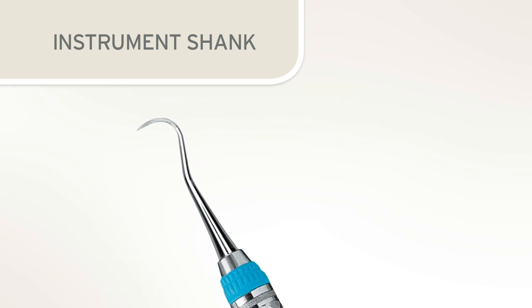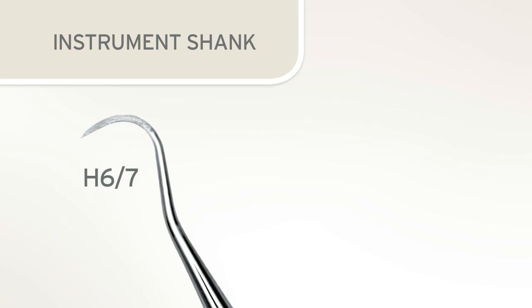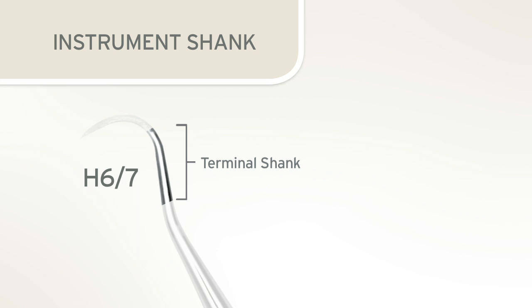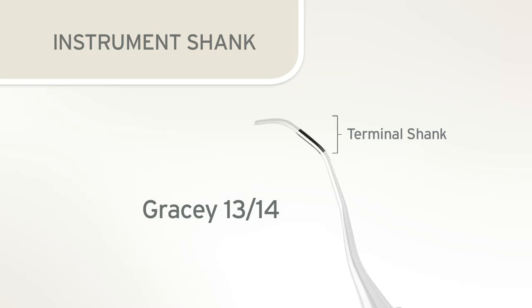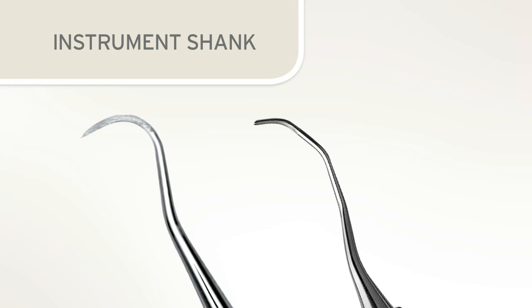For a sickle scaler such as the H67, the terminal shank is rounded — it extends from the blade and blends into the functional shank. For a Gracie 1314, the terminal shank extends from the blade to the first bend. Both of these shank types will be important when aligning the blade for sharpening.